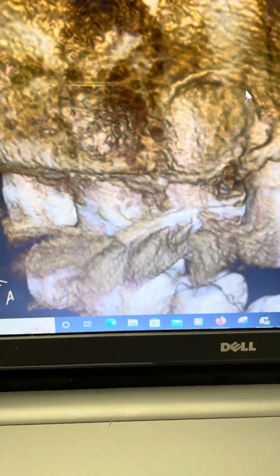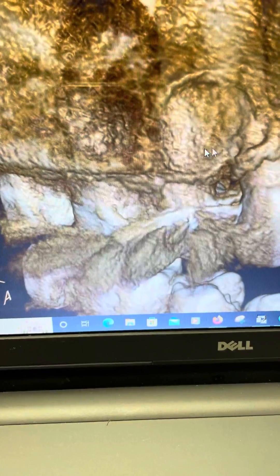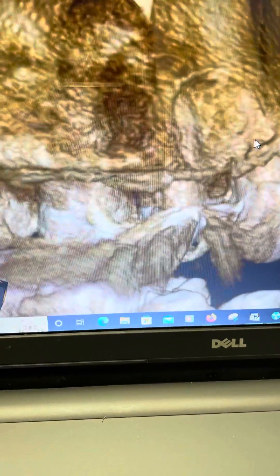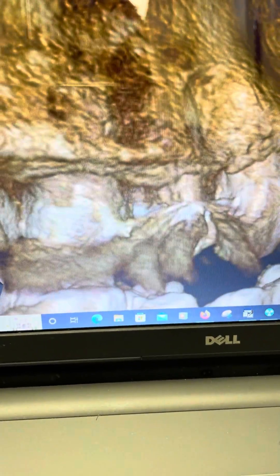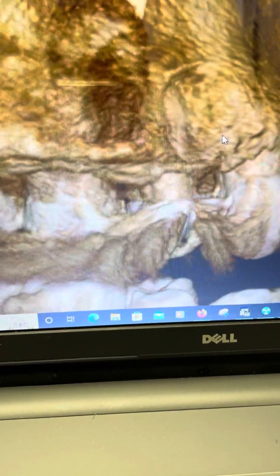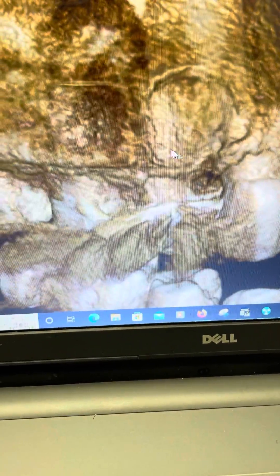We decided to do a 3D CBCT on this patient, and from the CBCT we can see this bone depression here. This is where that cyst-like structure is located.